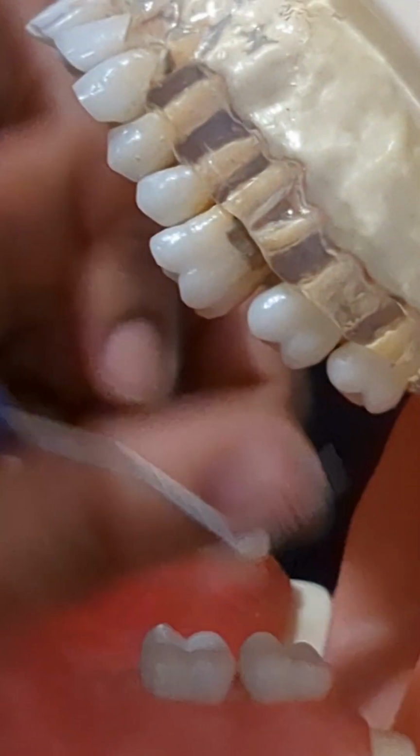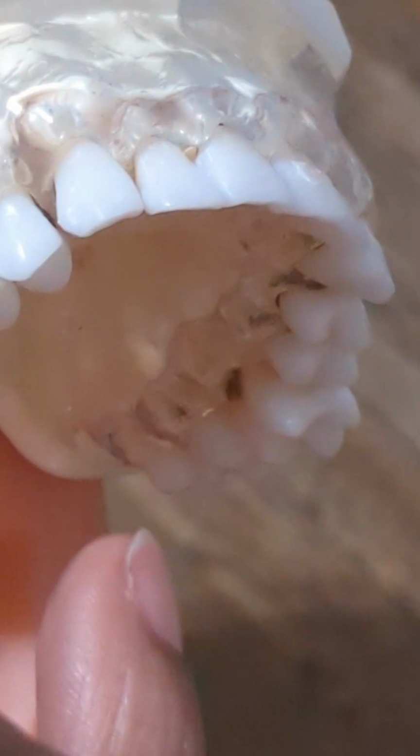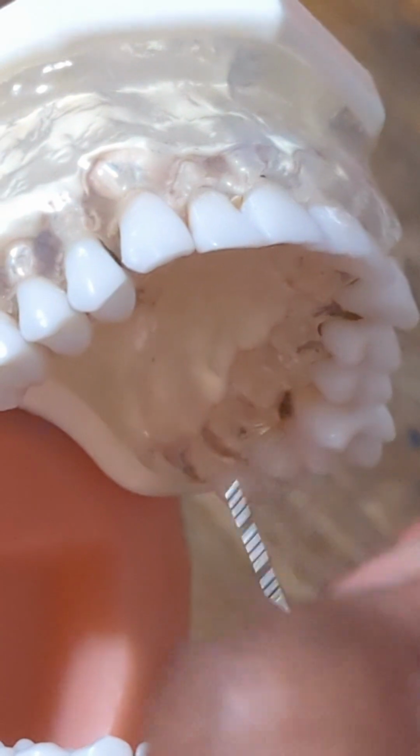Okay, now we're going to go to the lingual. Copy. Now we're moving on to the lingual, starting with tooth number 16. Again, from the distal line angle.